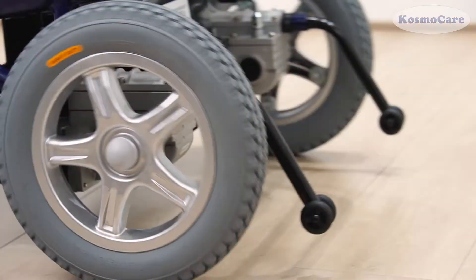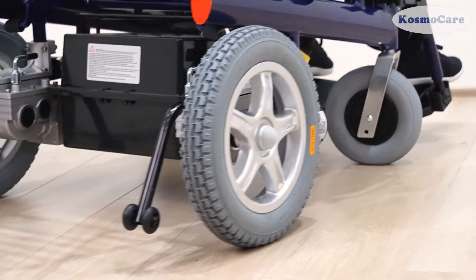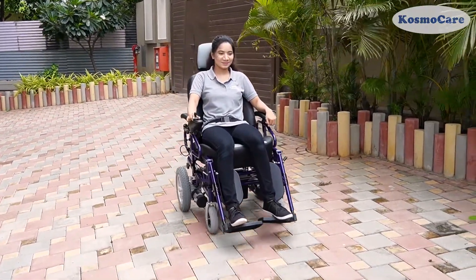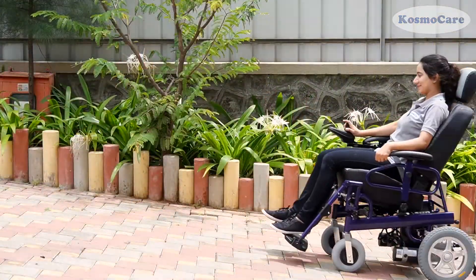The anti-tippers prevent the wheelchair from tipping backwards. The wheelchair comes with a lead-acid battery that can operate around 20 km on a full charge, with variable speed from 1 km per hour to 6 km per hour.